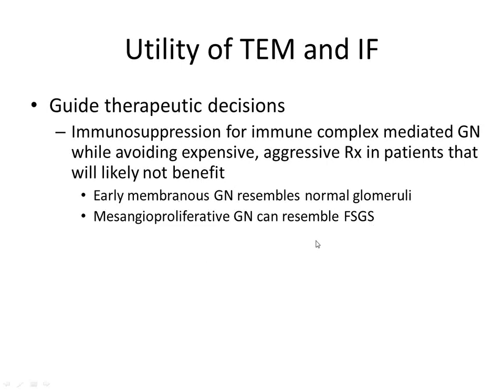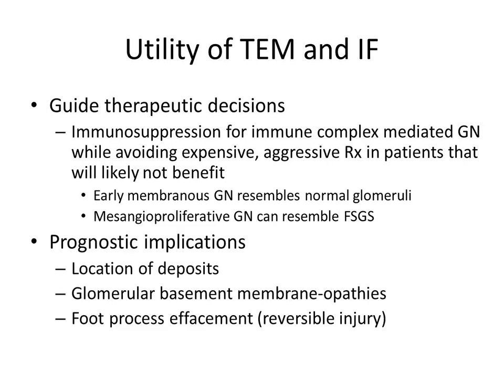So some of these diseases can overlap via light microscopy, and that's why you really need either immunofluorescence, hopefully immunofluorescence, and EM to really delineate which of these are mediated by immune complexes and which of these are non-immune complex mediated. And the paper at least tries to delineate that those are the two big branches of diseases we see in dogs.